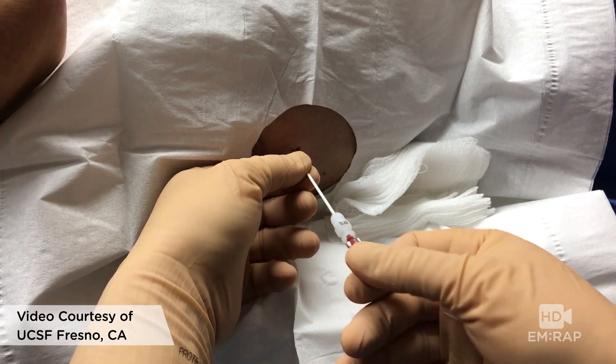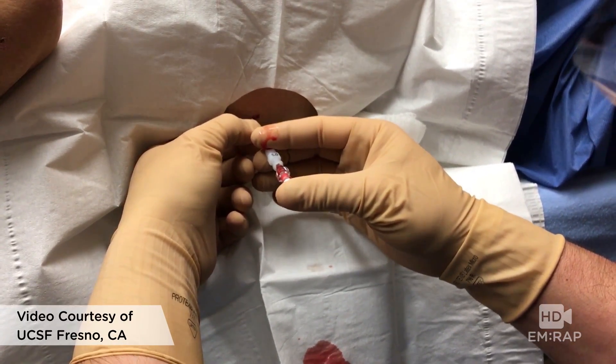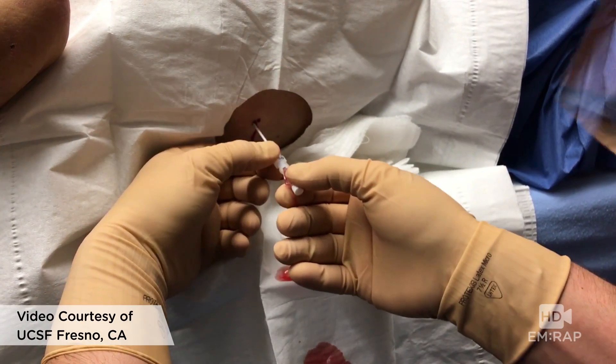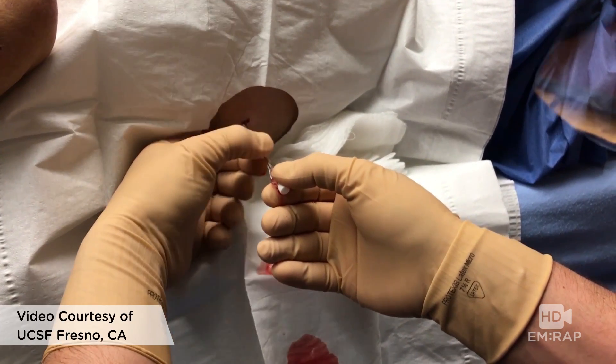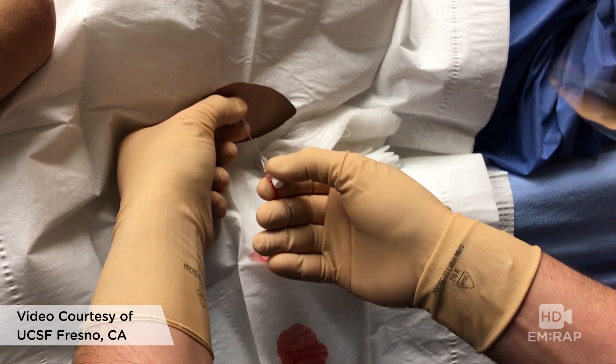Now important: do not withdraw the needle from the catheter until you get ascites fluid back, because if you withdraw the needle too early, you cannot then reinsert the needle — you might tear the catheter with the needle. Hold that needle still while advancing the catheter, and then you can withdraw the needle.